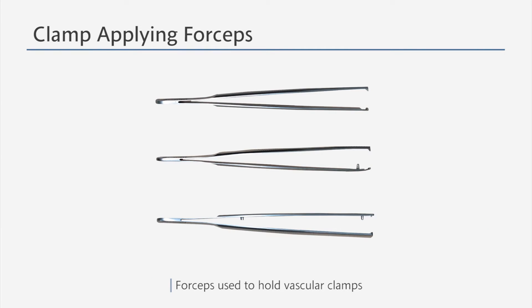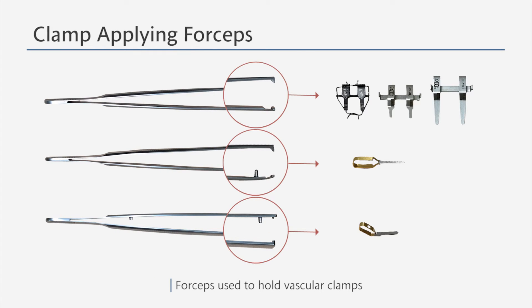These are the clamp applying forceps that are used when holding vascular clamps. When clamping, please use appropriate forceps according to the shape of the vascular clamp. Furthermore, please remember not to use the jewelers' forceps when dealing with vascular clamps.